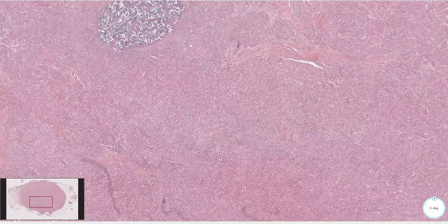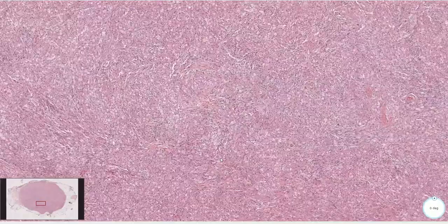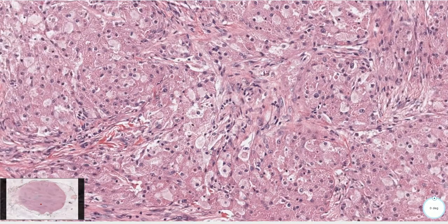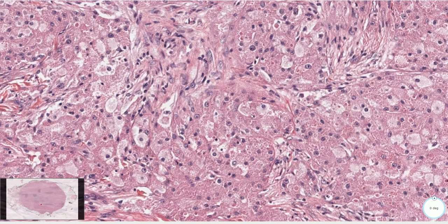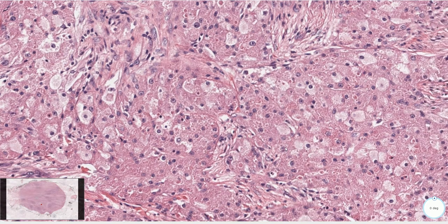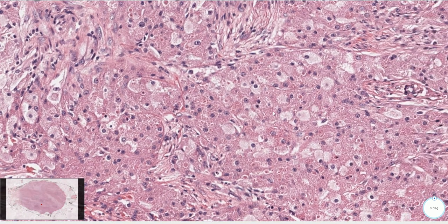On higher magnification we can see that this lesion is composed of relatively uniform cells with round nuclei with single nucleoli and relatively voluminous granular cytoplasm. This finely granular eosinophilic cytoplasm is a very important morphological clue and, together with bland nuclei, it is typical for granular cell tumor.